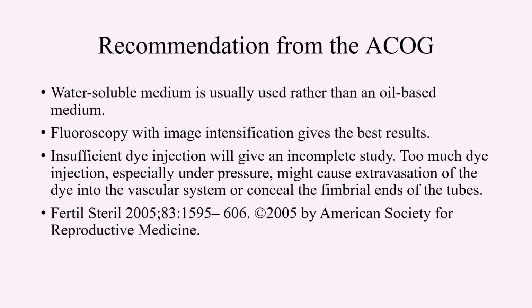Water-soluble medium should be used rather than oil-based medium. Fluoroscopy with image intensification will give the best results. Insufficient dye injection will give an incomplete study. Too much dye injection, especially under pressure, might cause extravasation of the dye into the vascular system or conceal the fimbrial ends of the tubes.